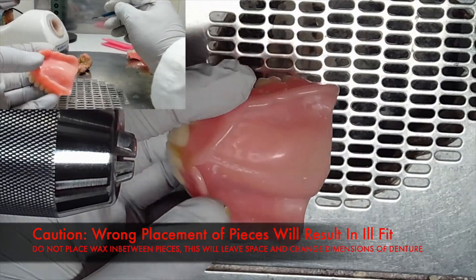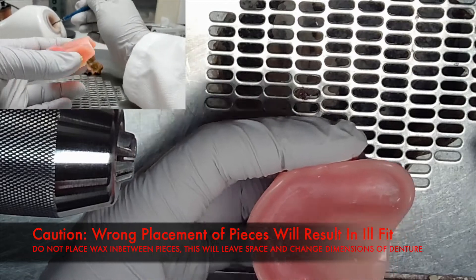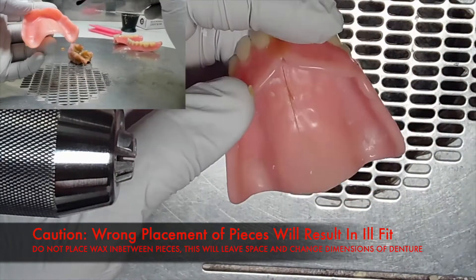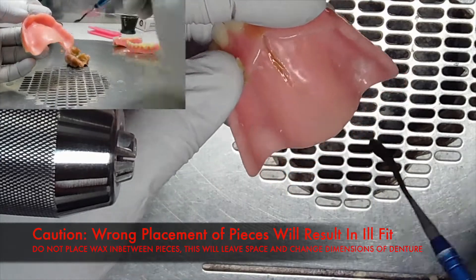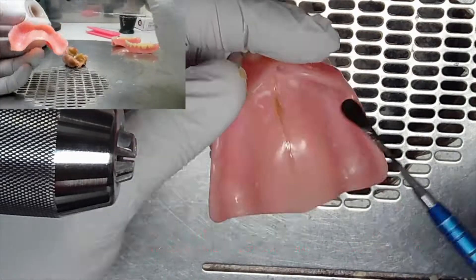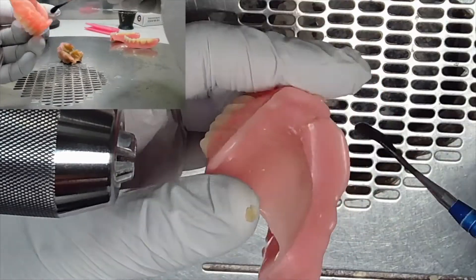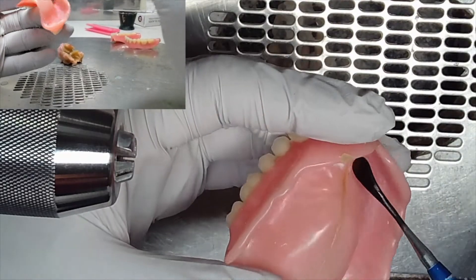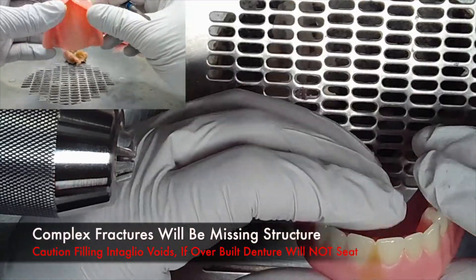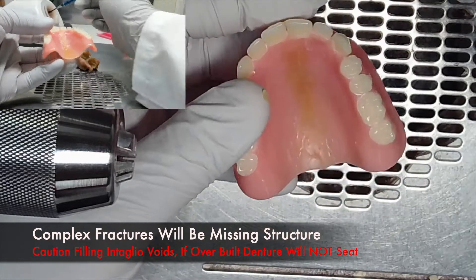Take caution — wrong placement of the pieces will result in an ill fit. How you put these pieces together will determine the dimensions of the denture, so do not place wax in between the pieces, as it will leave a space changing the dimensions. This denture can be considered slightly complex due to the fact that there are some missing structures on the intaglio surface that may be chipped away during the fracture.